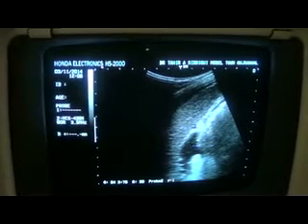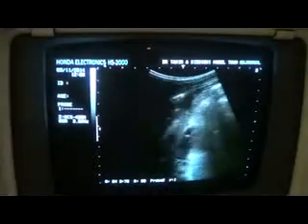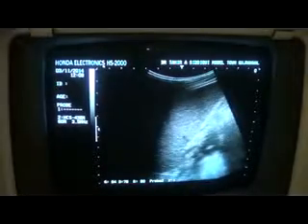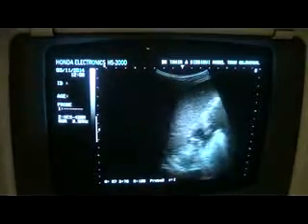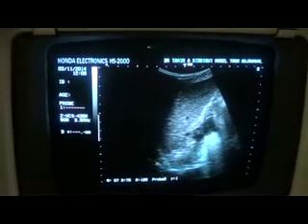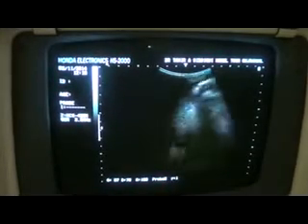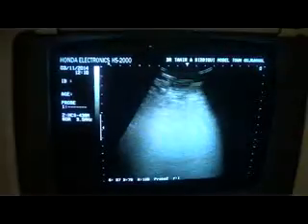This is again fluid. There is no fluid seen in the pleural space. If there is any, it is a small amount and sympathetic. No significant fluid seen, kidney is okay, small amount of ascitic fluid is seen.